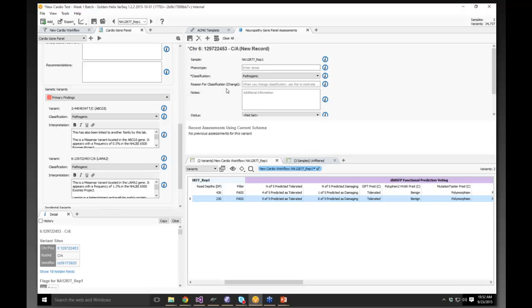So those can be linked up in the sense that if you've classified a variant as pathogenic, you can set it to default as pathogenic. Otherwise, maybe you set it as unknown significance as a default. Again, this is part of defining that lab workflow, how you want to plumb your data through, and how you want to capture information ongoing in a way that informs future projects.